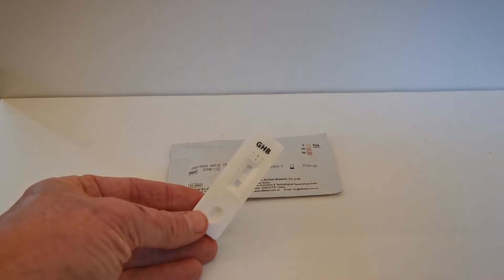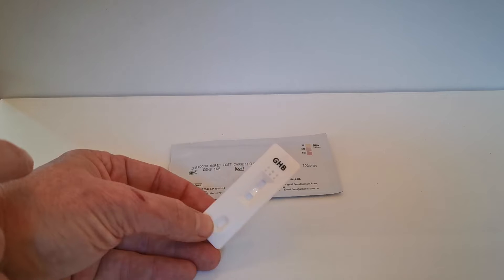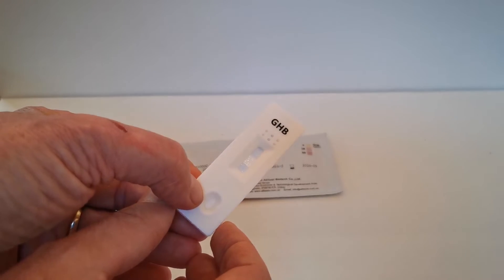Open the foil and what you get is a cassette marked GHB. The pad in the center section here appears quite light. Let me bring it close to the camera — you can see that is the results window.